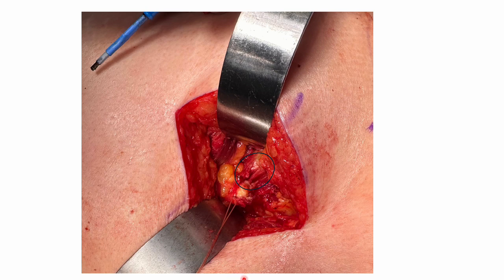In this slide, you can see the piriformis tendon after the tenotomy has been performed at the level of the greater trochanter. What I'm pointing out here is, despite me pulling fairly hard on this tag stitch, the piriformis is not moving very much because, as often is the case in patients with piriformis syndrome, there are significant adhesions between the tendon and the underlying capsular tissue or to the nerve or other surrounding tissues. So this needs to be freed up. This is the next step in the surgery.